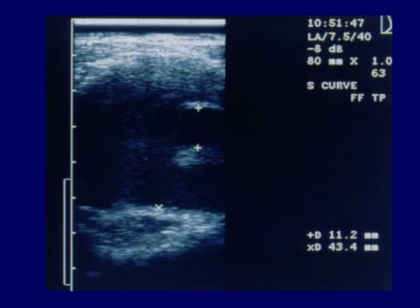The important thing when we talk about aneurysm is to make sure we document whether it's open or occluded. In this example, we see an old slide of a pretty large popliteal artery aneurysm. It's over 4 centimeters in diameter, but there is a residual lumen, and flow is coursing over and through all this laminated thrombus. This presents a significant risk to the patient for thromboemboli to the digital vessels, resulting in something like blue toe syndrome.